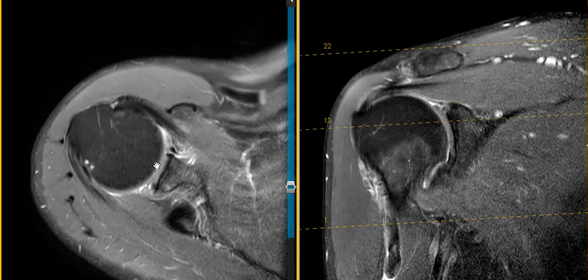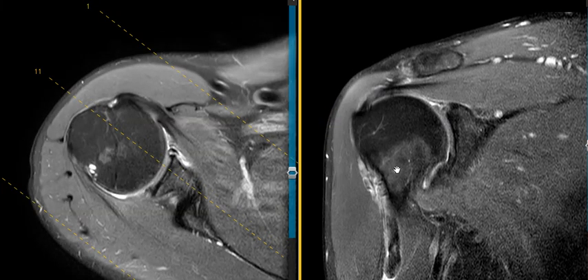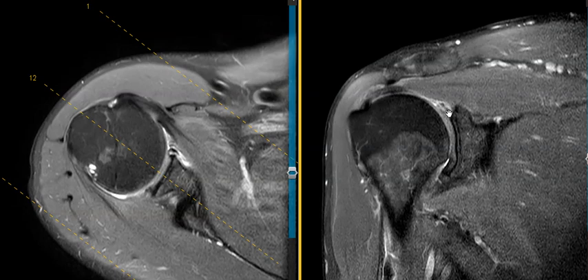So this is an isolated tear of the biceps tendon from the labral anchor and an associated tear of the superior labrum. The rotator cuff here is intact — often we see a rotator cuff tear with the biceps tearing associated with this, but this is just a pulling injury where it popped the biceps tendon and tore the superior labrum. Thank you very much.